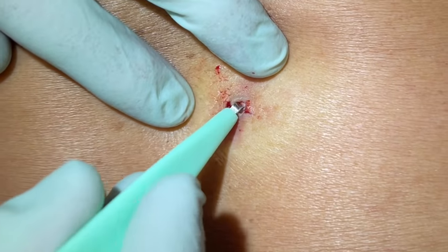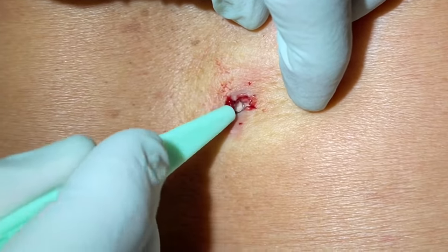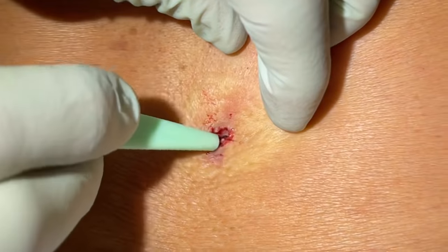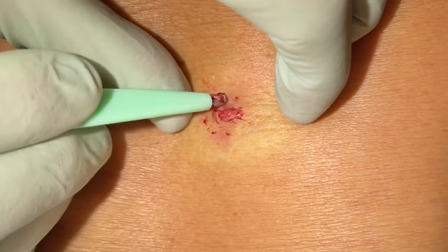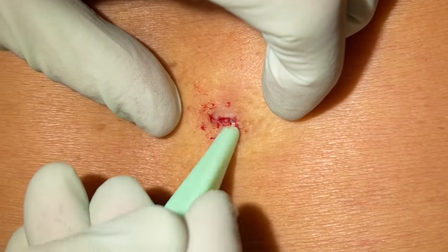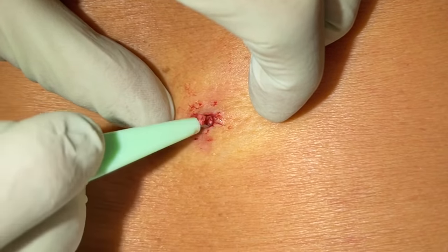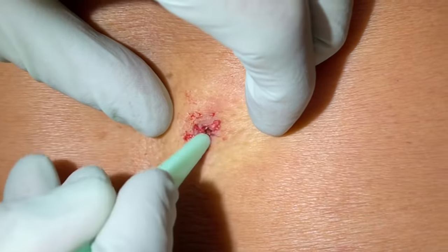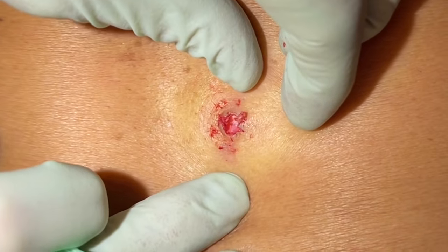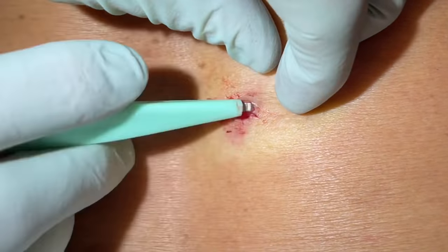It looks pretty shallow but we're going to see what we can get with the curette. We can get in here since she's numb — we can really scrape some of these contents out. Just kind of dead skin there. Let's see how much we're going to get out here. This doesn't go that deep — that's just a big dilated pore there. Getting all these little contents, just little dead skin particles, cyst particles at the bottom.